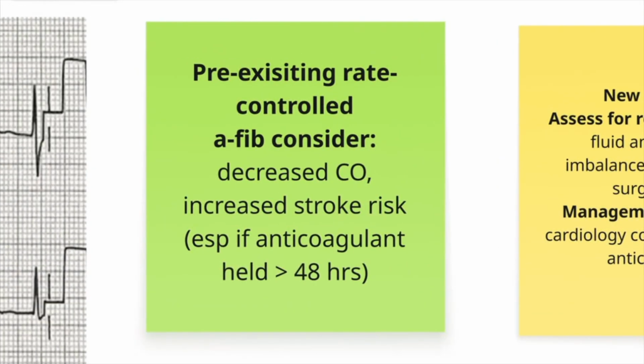Pre-existing atrial fibrillation that is rate-controlled and hemodynamically stable is often tolerated during surgery. However, it is important to remember that the loss of atrial contraction comes with a decreased cardiac output and increased stroke risk, especially if anticoagulation has been held for more than 48 hours.